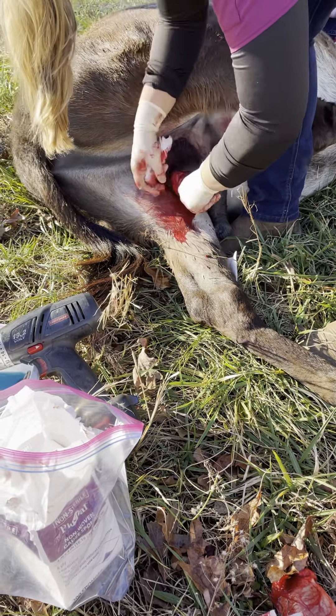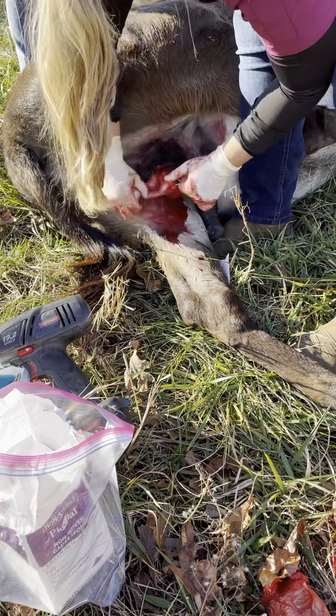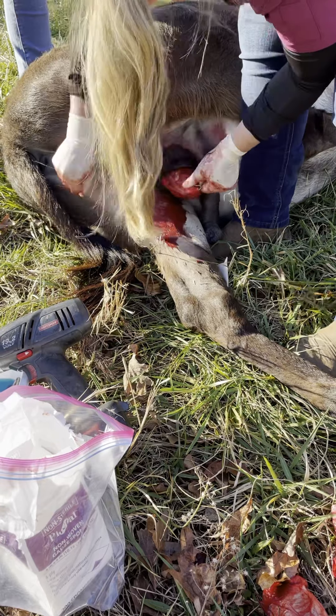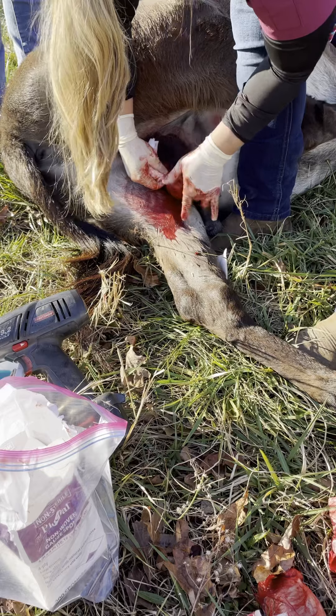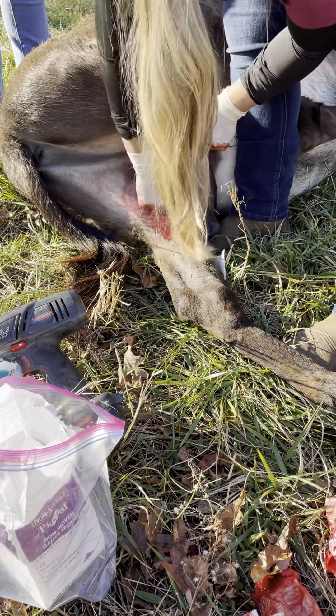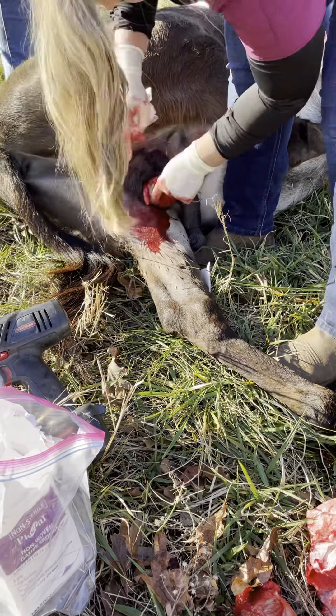I don't want to give them a ton of drugs — we'll be here all day waiting for them to wake up. But I have to get this fat off. Oh, I can put the clamp on. There's so much. It's everywhere.